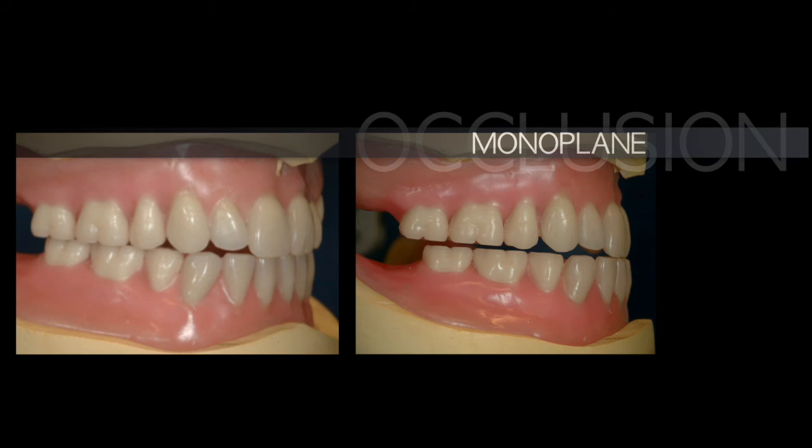With monoplane, as described, the anterior teeth do not have any vertical overlap, and the posterior teeth are set completely flat. In this setup, when the patient moves in protrusion, the posterior teeth separate due to the Christensen phenomenon. So this is the monoplane setup, maxillary and mandibular. When the patient makes a protrusive movement or incises with the front teeth, as you notice, due to the condylar inclination and the Christensen phenomenon, the posterior teeth separate and have no contact.